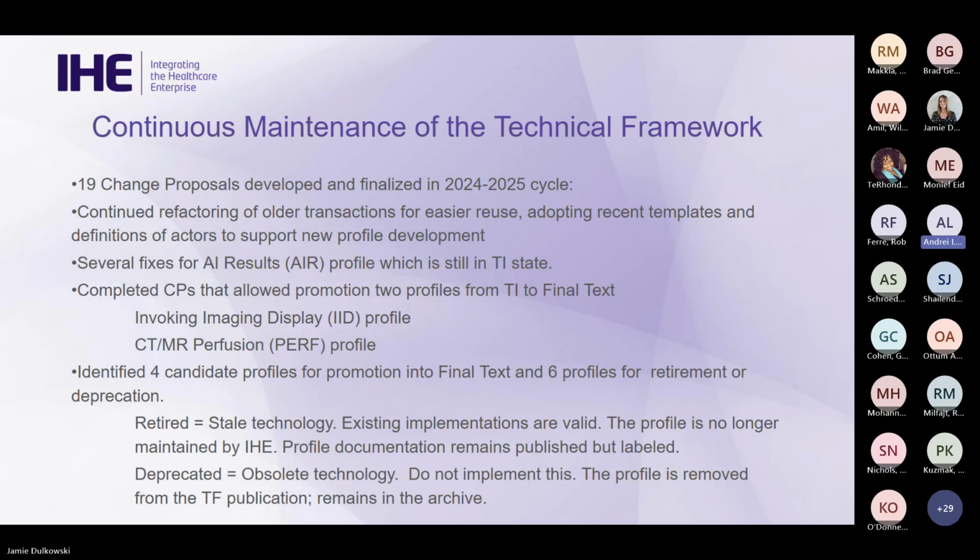Don't try to implement them. Typically, the deprecated profiles will have a very well developed modern replacement for them, and that's what typically would be a recommendation. These profiles will be removed from the TF publication. They will remain in the archive, but again, we will strongly recommend not to implement those profiles in any new developments. That is on the continuous maintenance.